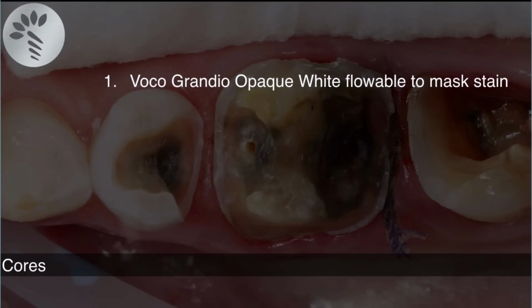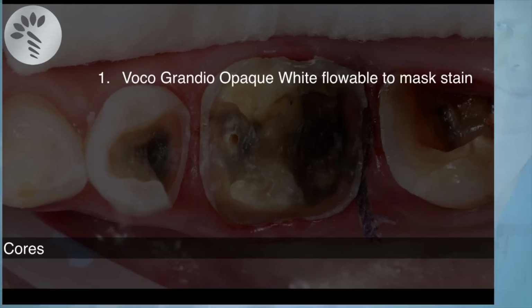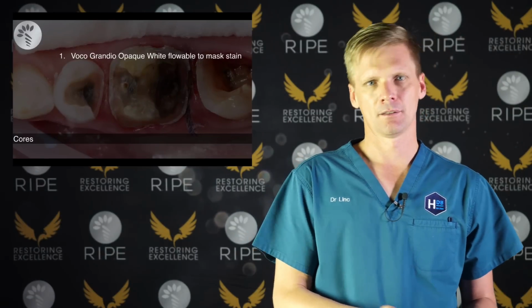Silver oxide is not caries. But I don't want it shining through, because sometimes our ceramic crowns are a little bit translucent these days, and you can get it shining through. So I'm going to use something that's opaque to block. Okay, it looks nicer in photos, that's for sure, but generally when things look nice, they are nice.